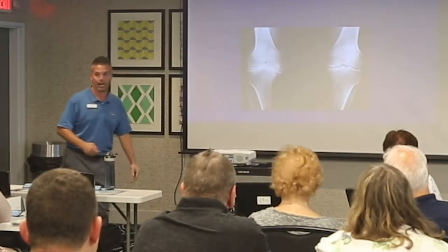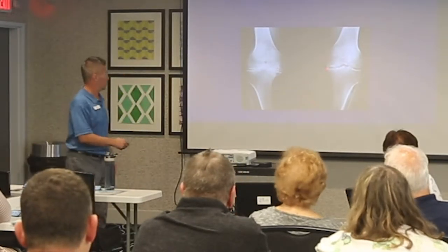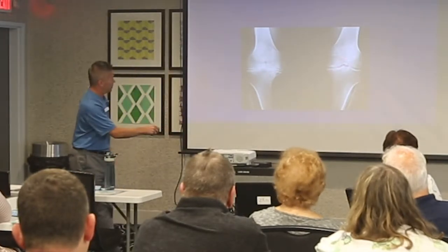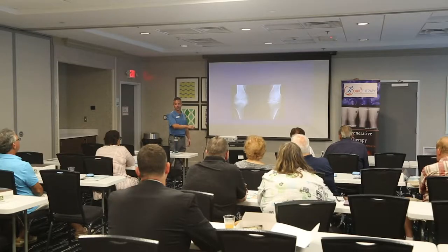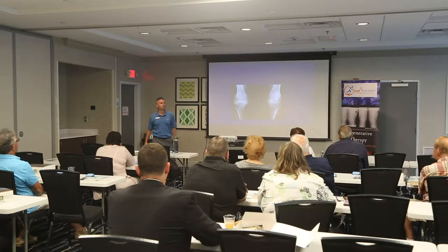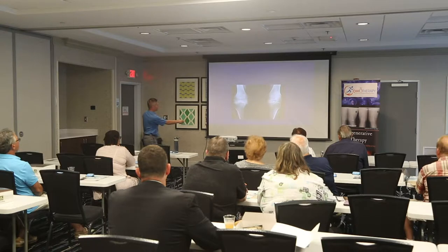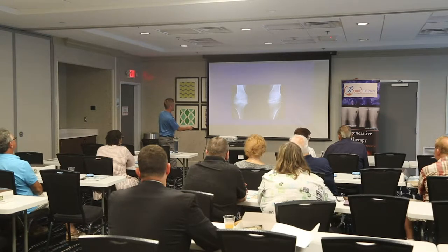Look at this poor guy. Yeah. So this is one individual, right knee, left knee. You can see that left knee's not good. That looks like that previous x-ray with the loss of the medial joint space. And I'll tell you what, when we talk about knees, 90%+ of the people that have arthritis, it's on the inside here. Right there. Most of these x-rays I'm gonna show you are like that. Loss of joint space when compared to that lateral aspect, but look at this one. Look at that knee, look at that right knee. Yeah, loss of joint space laterally and medially.